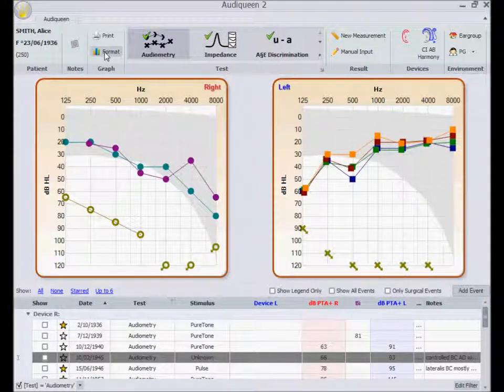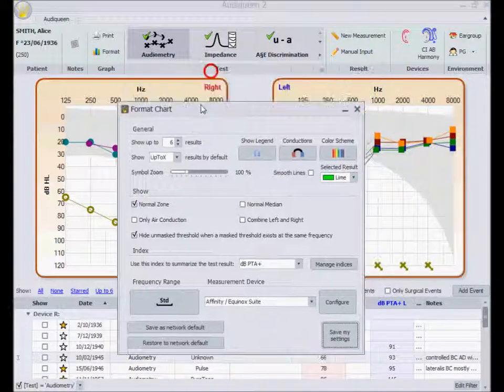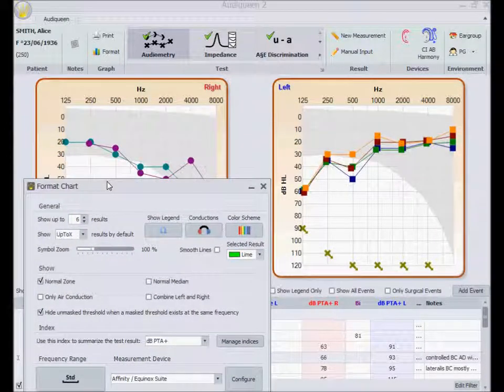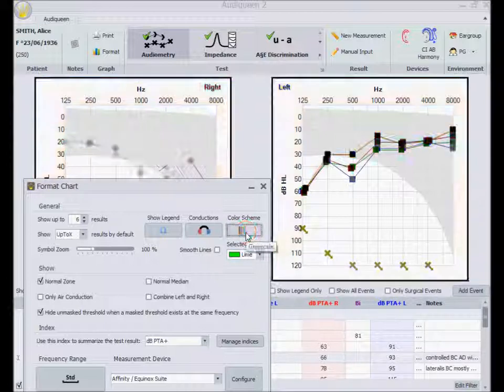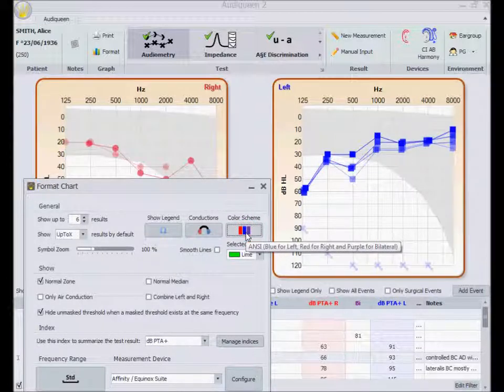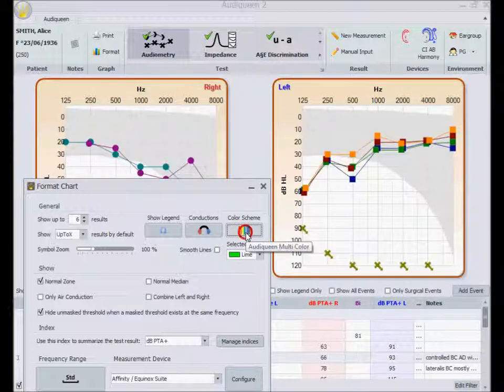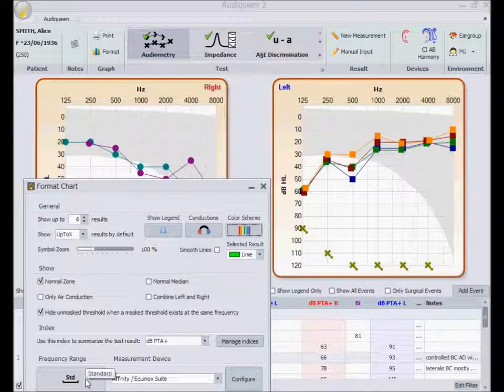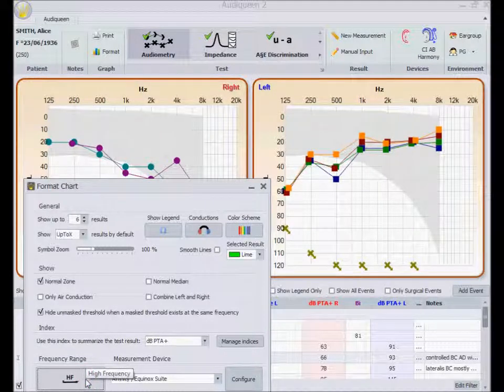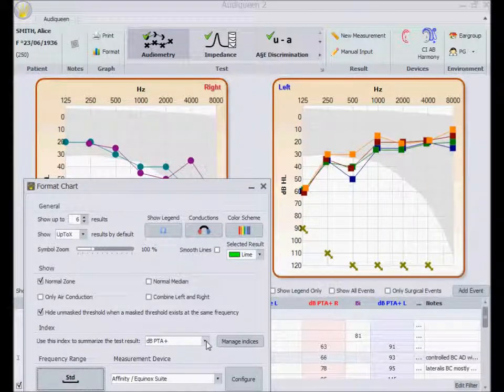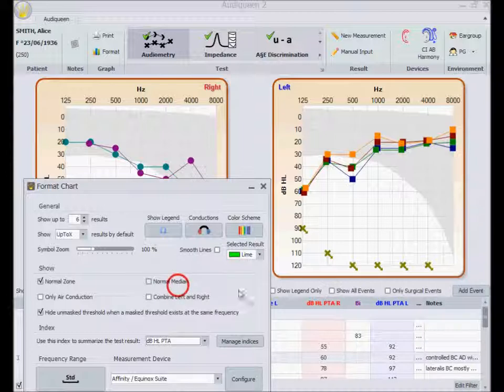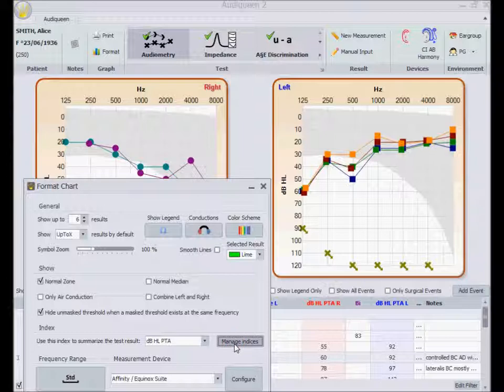This format button allows me to modify the looks, either for all tests, like for instance the colors used, or for this particular test. For instance, I can extend the graph to high frequencies, or I can select a different index. This will have an immediate impact on the results shown in the list. This function allows me to define any index of my choice.